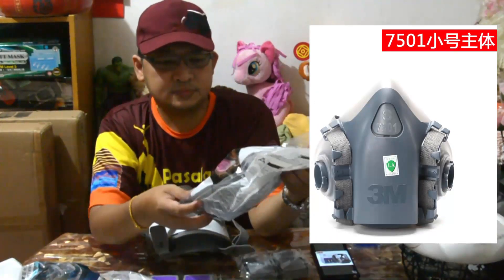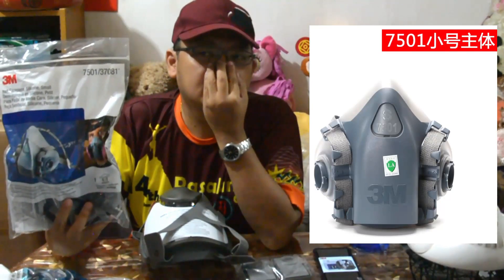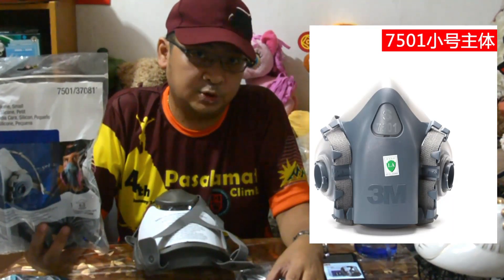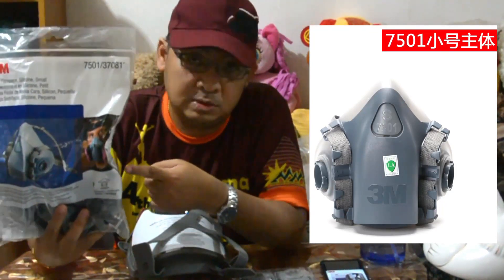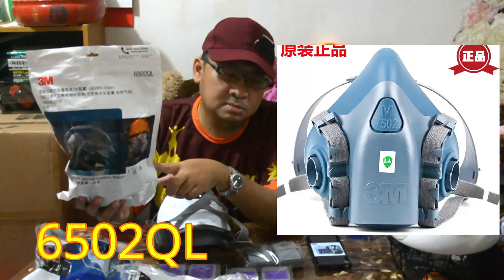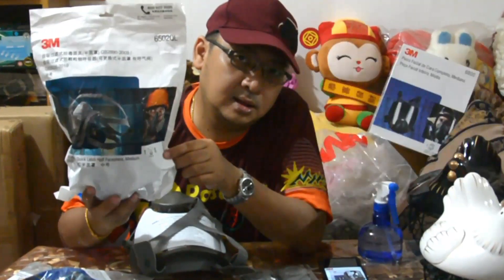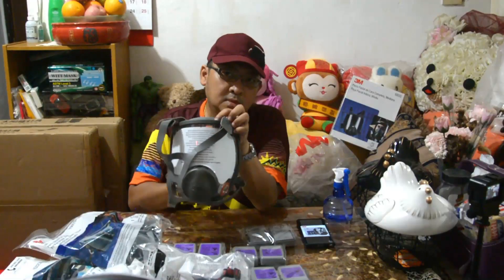Ito ay small half mask. Ito rin yung gagamitin mong filter — pang hospital, pang anti-coronavirus. Sa taas, sa gilid, may picture — ito yung picture niya sa loob. Hindi ko na bubuksan kasi para secure yung lalim na ladies pa rin. Inorder ko to kasi small size. Itong code na to ay 6502QL. Ito ay medium. Kung hindi siya kasiya, gagamitin niya — medium. Walang small dito.